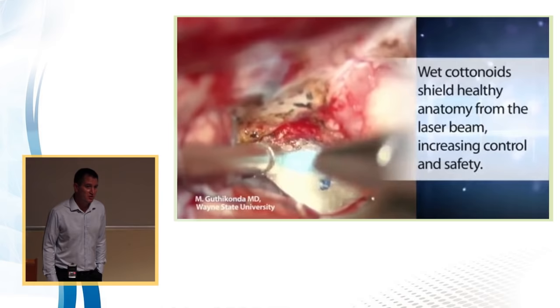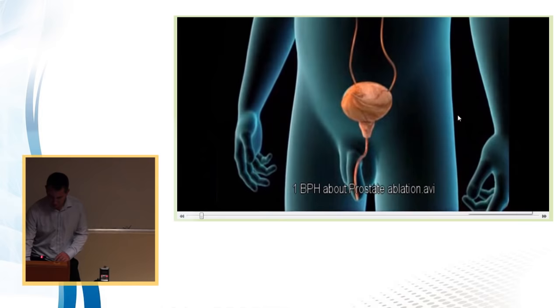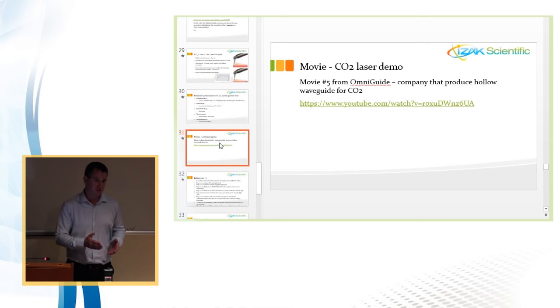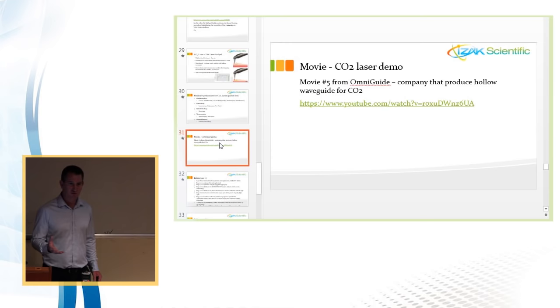This is prostatic hyperplasia. This is just an order of magnitude, and there is an aesthetic application with the ultrapulse that is shorter. The CO2 laser can be excited with an RF source. So by this, there is an option to do an ultrapulse one after the other, with pulse modulation. It becomes very narrow, very short, and the pulse itself, the envelope, is also very short.